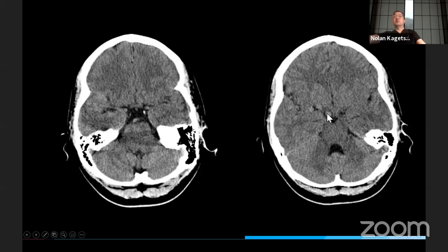So somebody said, what made you choose neuroradiology? Well, radiology is kind of like solving puzzles, right? I like puzzles, and so this is kind of a puzzle. And so these probably are blood vessels. You could argue they're veins, because if vessels get enlarged, which vessels get enlarged more, arteries or veins? It's usually the veins. So if you see round balls, it could be an artery in cross section, or a vessel in cross section, and so probably a vein.